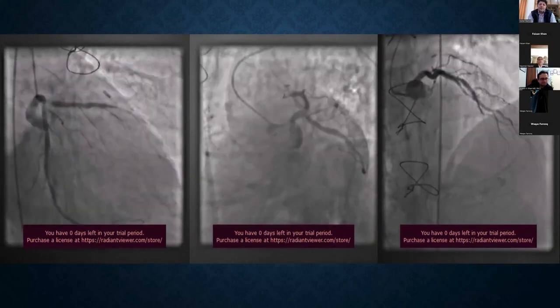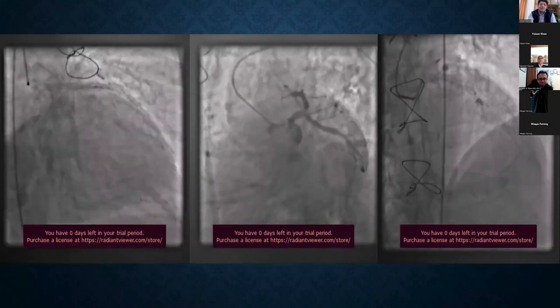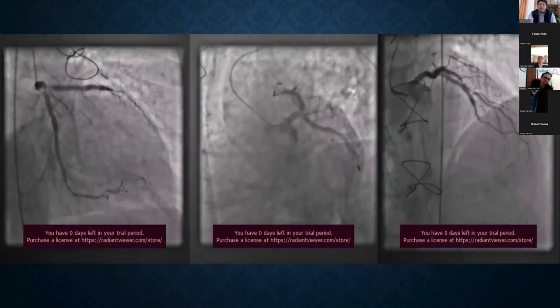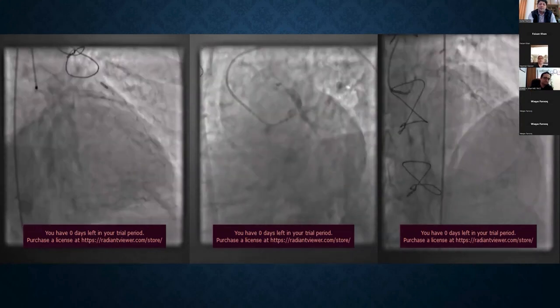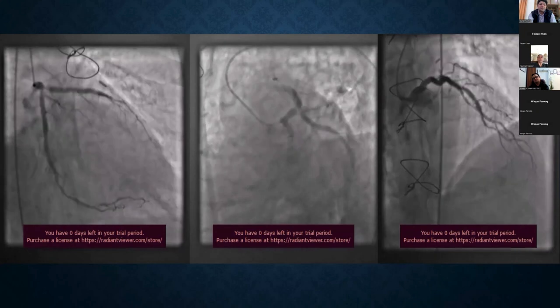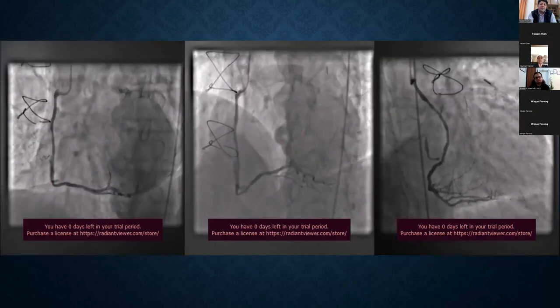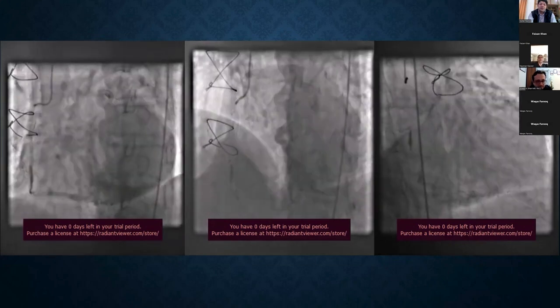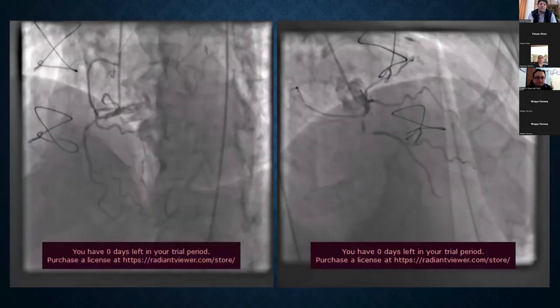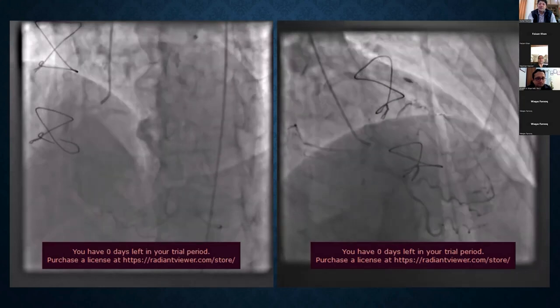So this is the angiogram of that left main bifurcation lesion. You can appreciate left main bifurcation ISR lesion, severe distal left main, severe ostial LAD, and severe ostial circumflex lesion. On the cranial view, you can see LAD is totally occluded and continuing as a prominent diagonal branch. This is the SVG to RCA, which was previously stented. Its relook angiogram showed a patent stent. And native RCA had a severe proximal lesion and total mid occlusion, and its RV branch was actually filling that LAD.